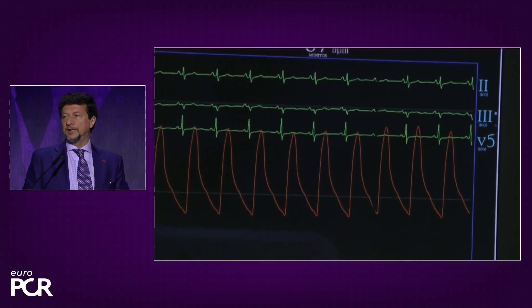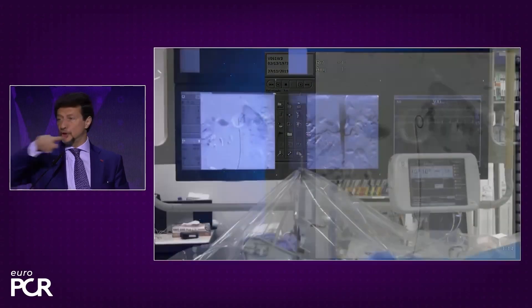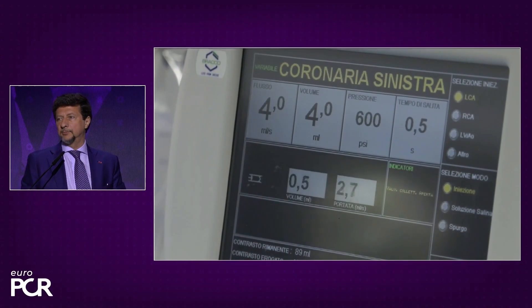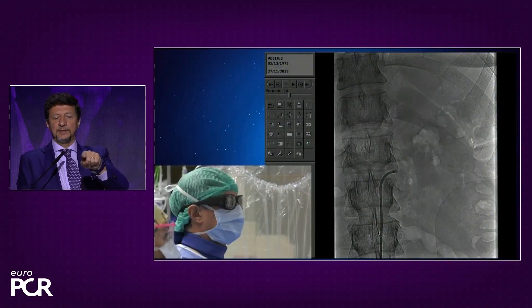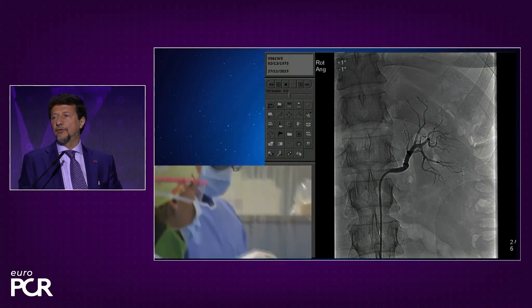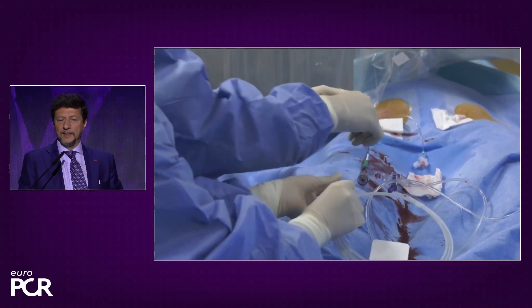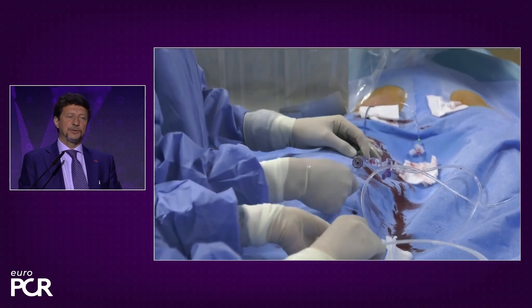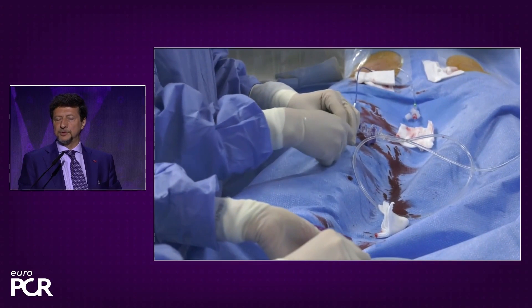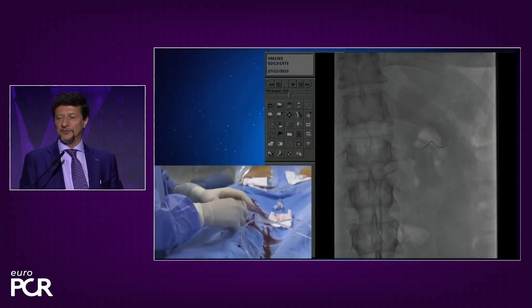These are important numbers because in our experience, a renal denervation can be done with less than 60 or 70 milliliters of contrast, which is very important — especially because no patient benefits from contrast, particularly those with impaired renal function. You see that the rate of injection is four milliliters to get a very nice selective injection. Since we are not concerned about safety in terms of vascular obstruction, dissections or spasms that resolve spontaneously, we don't check continuously the state of the artery, just a final check to make sure it is open.